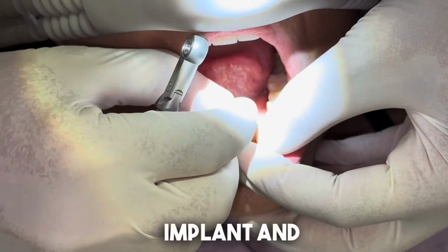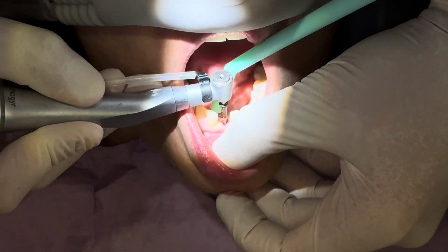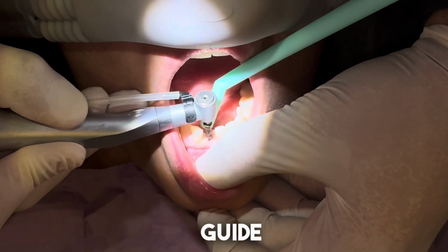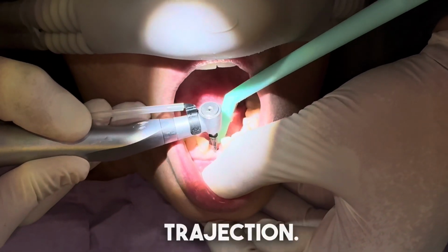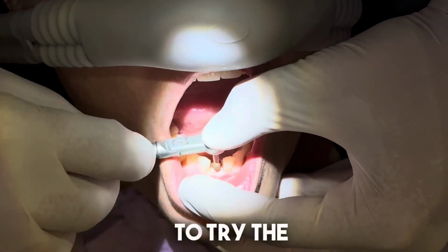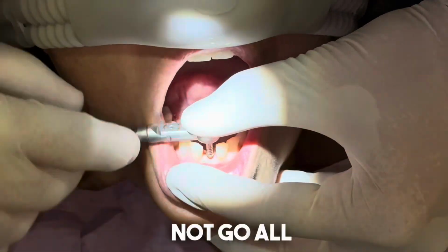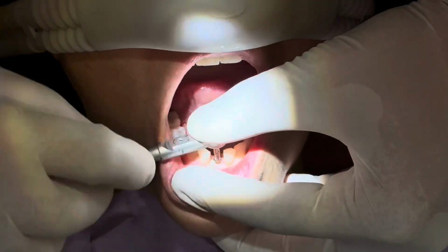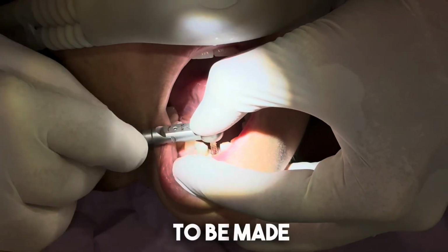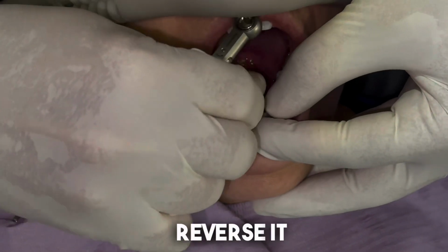Okay, I'm backing out the implant, and I'm deciding to drill further, and sometimes we do this without the guide because we already have the path of the trajectory. And what you'll see is I'm going to try the implant placement again, and it does not go all the way down to the length I want. So an executive decision has to be made to remove the implant. That's what I'm going to do. I'm going to reverse it out.